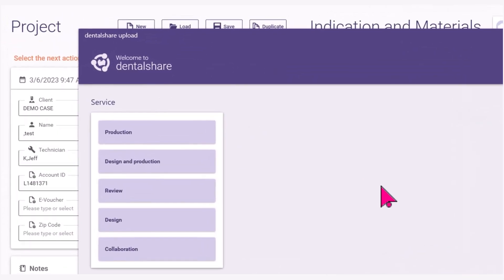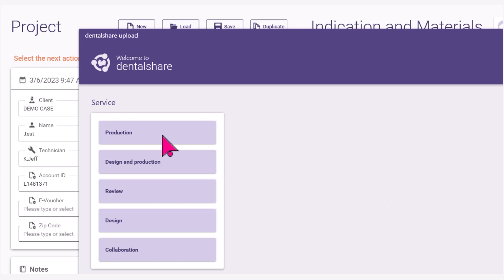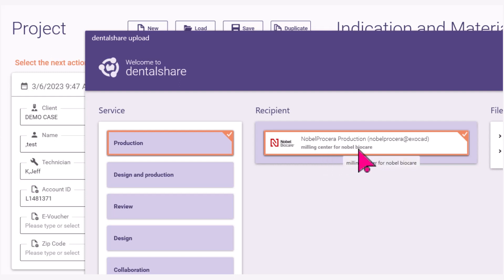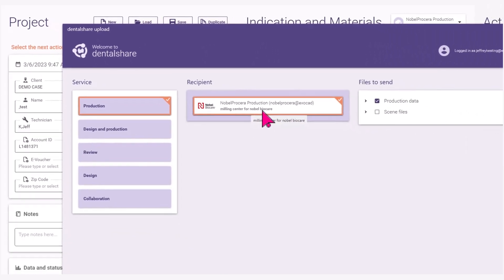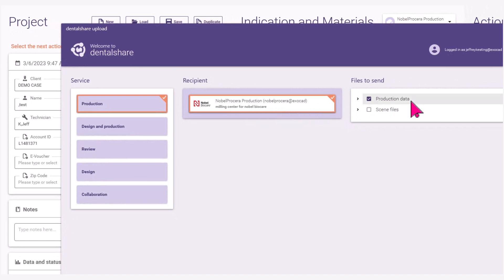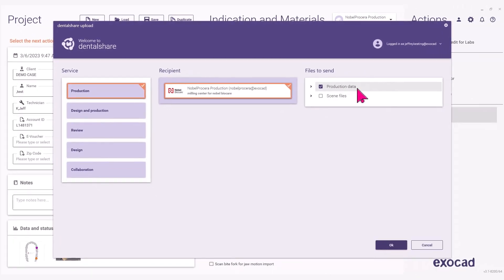Select these options: for Service, select Production; Recipient will be Noble Procera Production — Noble Procera at ExoCAD Milling Center for Noble BioCare. For Files to Send, select Production Data Only. Click OK to send files.